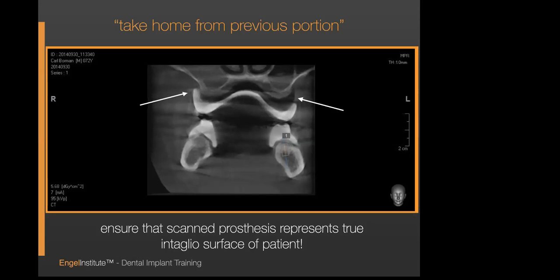The other thing I want to mention is don't have your patient bite on any bite sticks in any CT. If you do, they do not have proprioception and the denture will lift. So my recommendation is 6 cotton rolls. Actually, we're going to place 4 on the top, and we're going to place 6 on the bottom. So we're going to place 2 in the vestibule, cotton rolls on the top, and we're going to place 1 on each side between the bicuspids and the molars, have them gently bite down, and they feel it until they feel it close. We are not pressing.